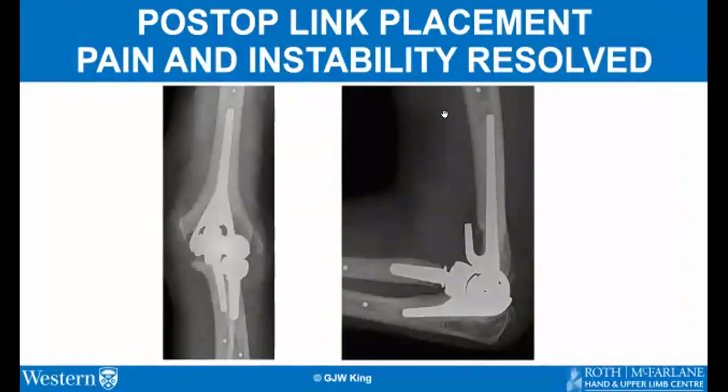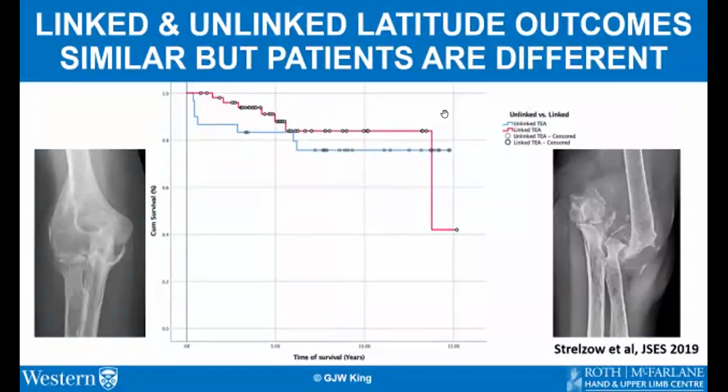Postoperatively, stability was restored, and the patient's clinical outcome has remained good. Our experience with the Latitude implant has been that the overall long-term outcomes have been similar between linked and unlinked devices. However, the patients are quite a bit different.